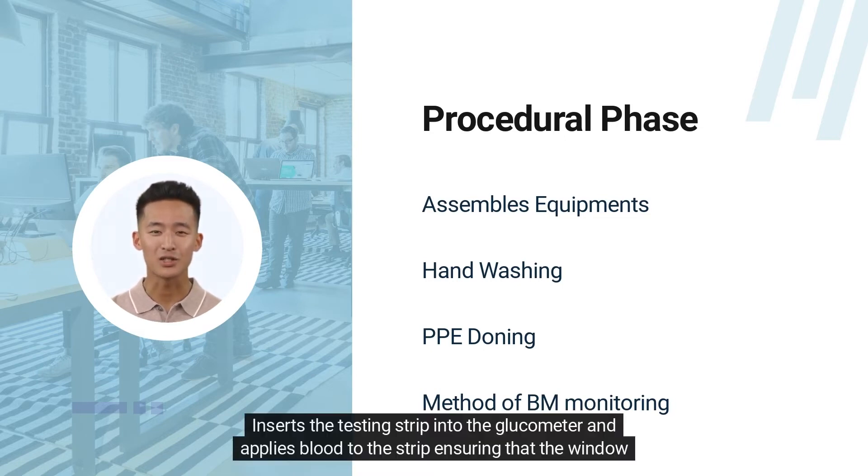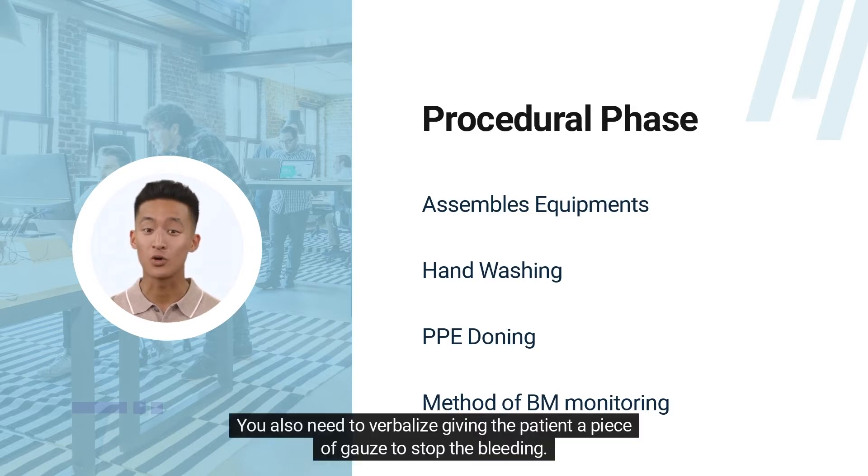Insert the testing strip into the glucometer and apply blood to the strip, ensuring that the window on the test strip is entirely covered with blood. You also need to verbalize giving the patient a piece of gauze to stop the bleeding.